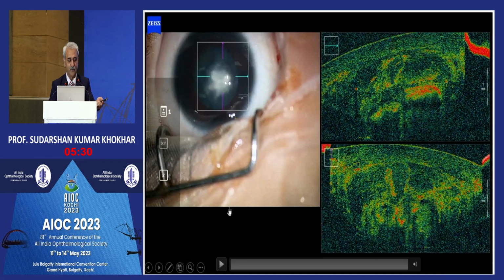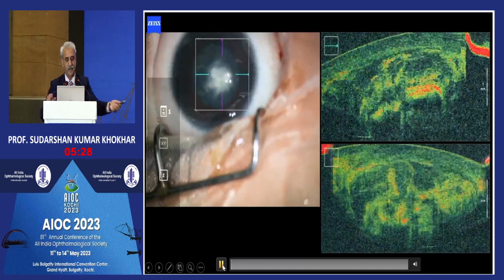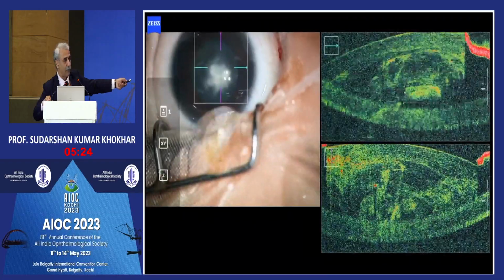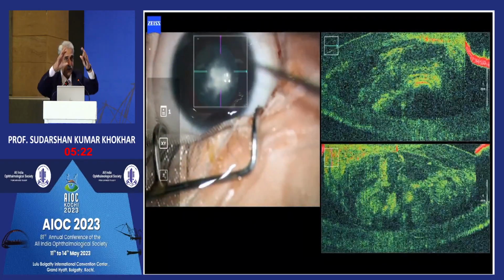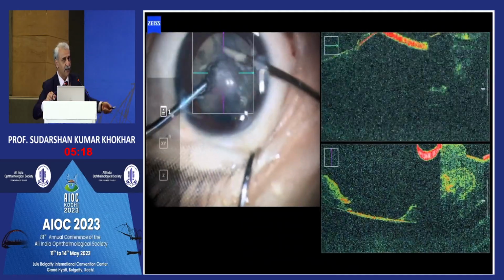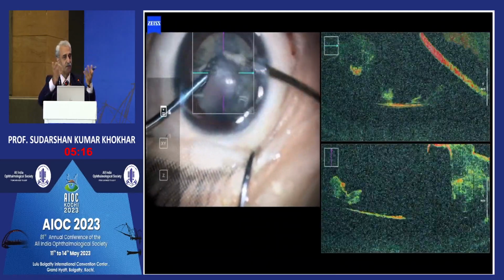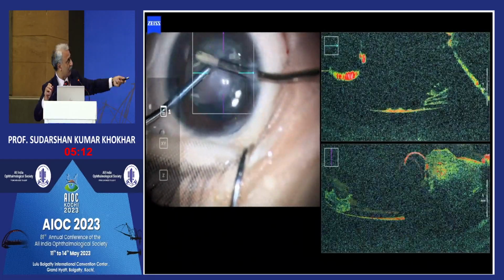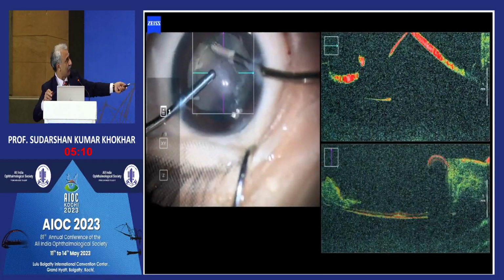So this is video number 1 in which you can actually see the cataract. You can see the morphology up here. So this is not a typical zonular lamellar, because you can see there's a little more translucency in the periphery, and the central part is much denser. Whereas the lamellas normally have a consistency all around. You can have a central lamella, central nuclear also, but this was a different thing. So that you can pick up on that one.